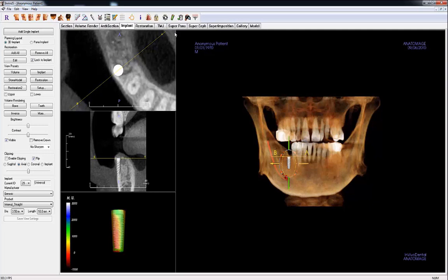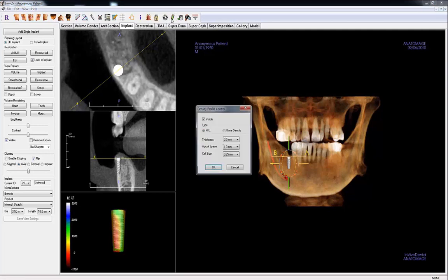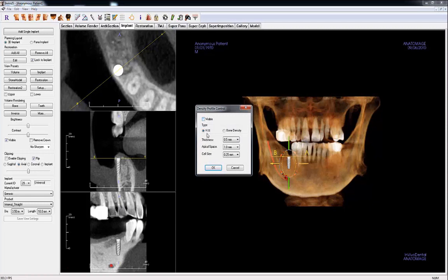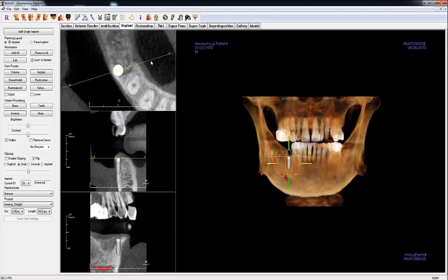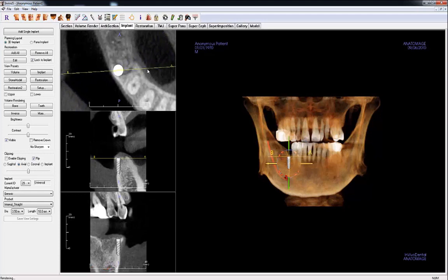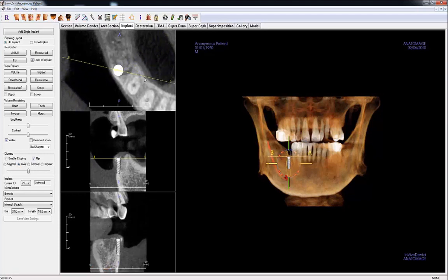You can turn this view off by clicking Density Profile Control and unchecking the visible box. You will then see an additional cross-section that is perpendicular to the yellow AB line. As you rotate the yellow AB line, the middle and bottom cross-sections will also update.